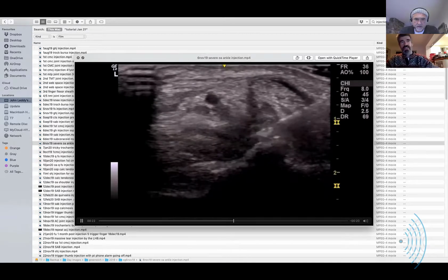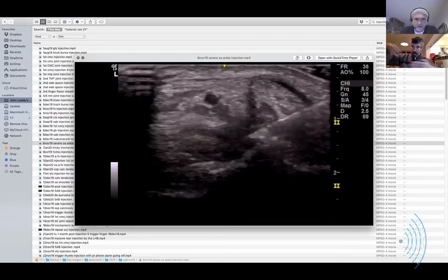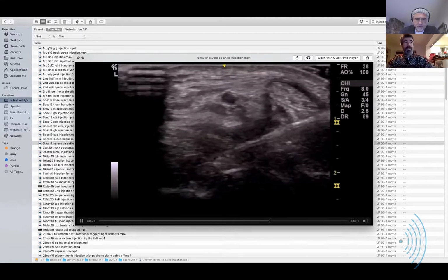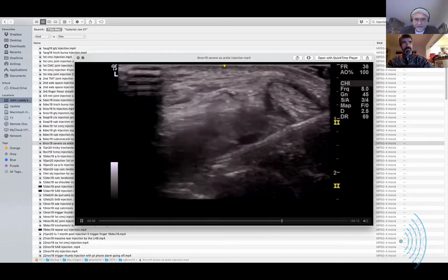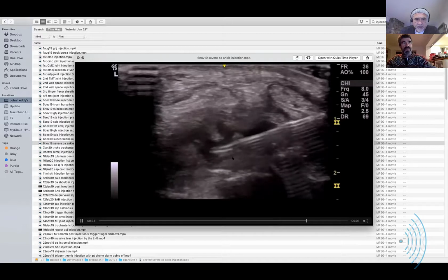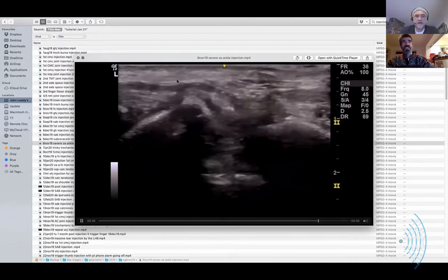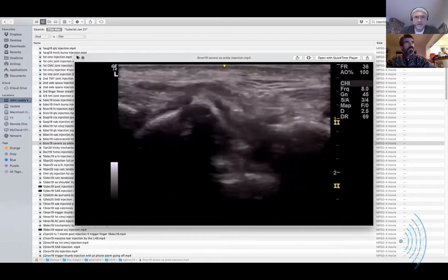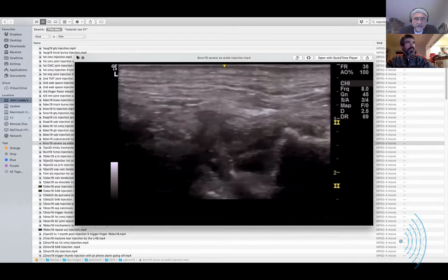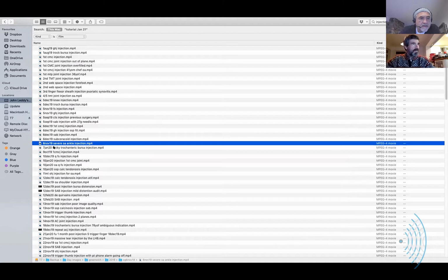So I've gone in under tibialis anterior in that axis. So, and I'm going to rest it. You're going to place it above the talus then? Yeah, so there I've just gone in above the talus, which is not my standard approach at all. But like I said, I've not gone in and edited these tricky ones.